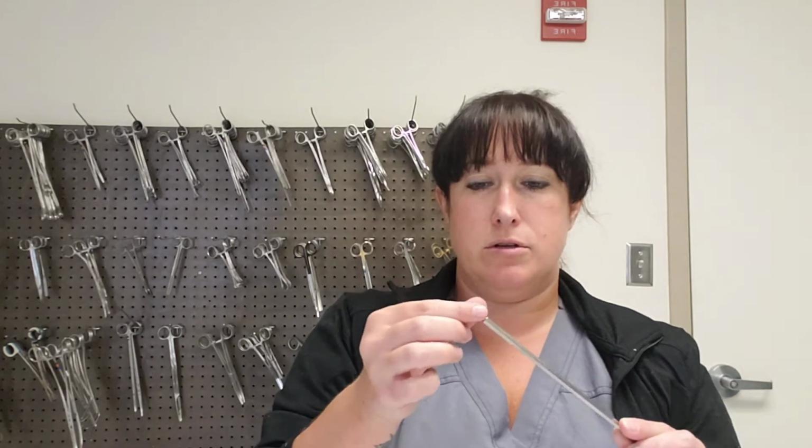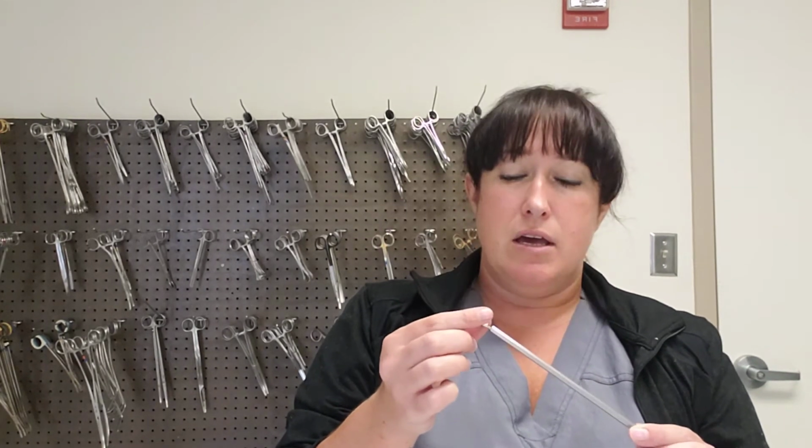And what you can do is just screw it back in, but man, it's so important that you don't lose these, because if it comes apart, there's always a chance that it can end up in the body. So keep an eye on this, all right? Don't lose it. Make sure it's on there tight enough to not become loose. There are different blades that you can use with this.